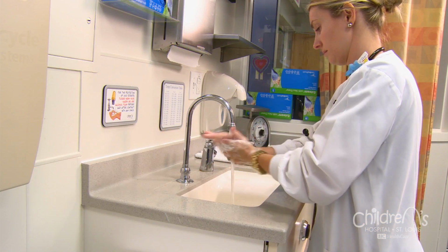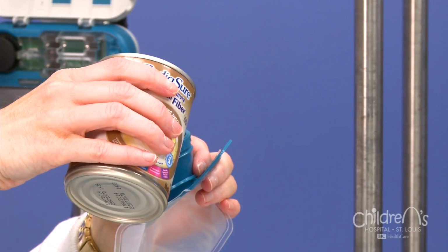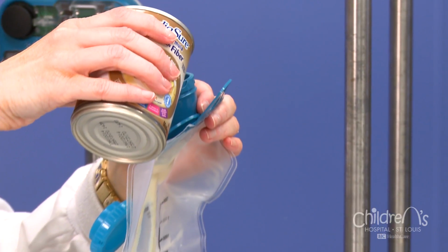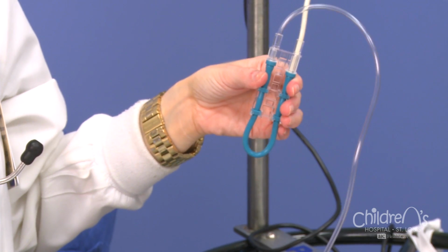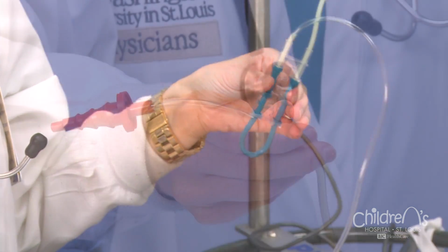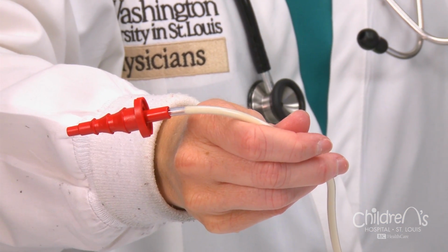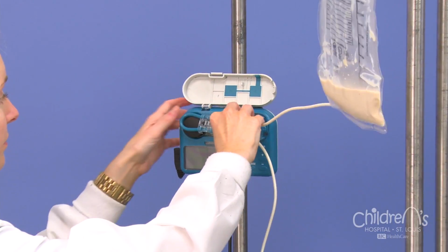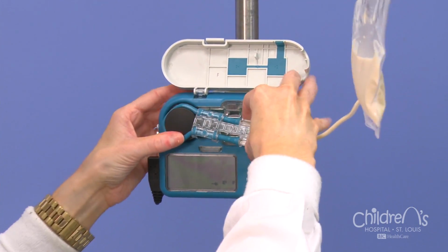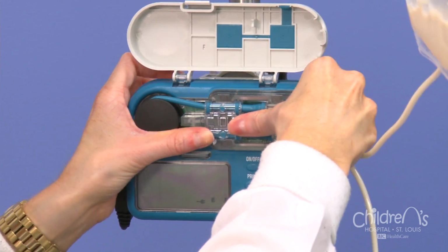Wash your hands. Pour the amount of formula needed into the feeding bag. Open the clamps of the feeding bag. Fill the tubing with formula. This is called priming. Then close clamps when the formula reaches the end of the tubing. Place the pump tubing into the pump and then attach extension tubing to the gastrostomy appliance.